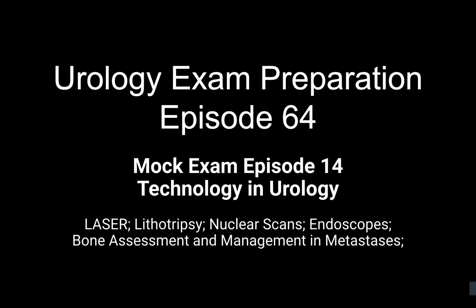Yes, nowadays smaller fibers are available. For example, the TFL fiber or the thulium fiber laser. The other laser that we can use is the thulium YAG laser. And for stones, we can also use diode lasers, but they're not very popular. I've never seen them being used.